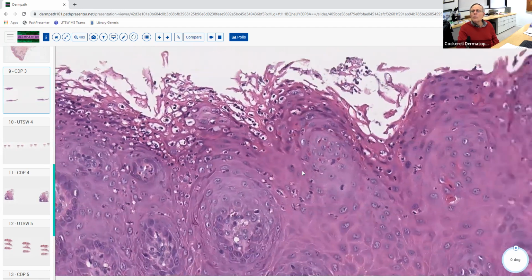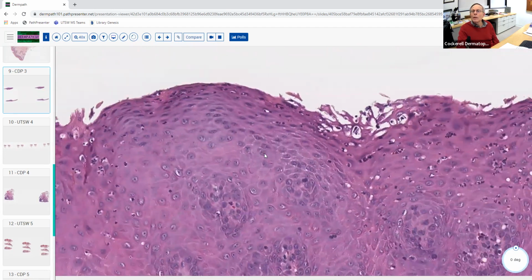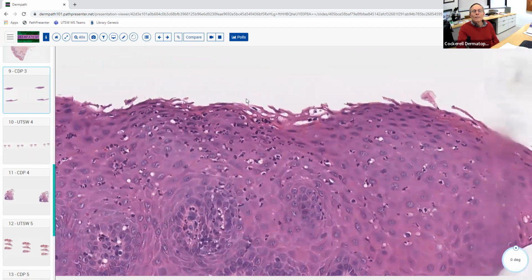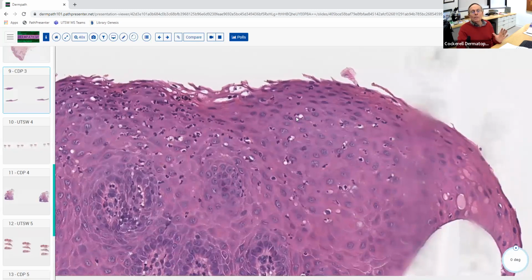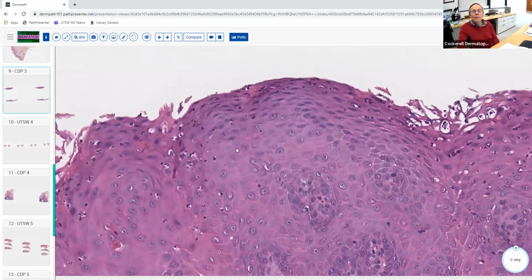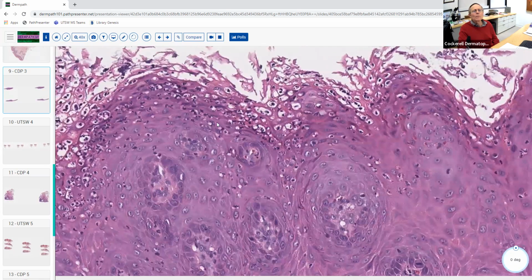Yeah, I'm just not seeing a really good example of the organisms here for you. I wish we had a PAS of this, would have been better. But if you look at Candida, the organisms live in the same area, but they are actually oriented at 90 degrees. So Candida likes to dig into the epithelium. It actually is drilling for oil, whereas the dermatophytes usually just live up in the cornified layer, and they don't usually, dermatophytes, as you know, don't really involve.